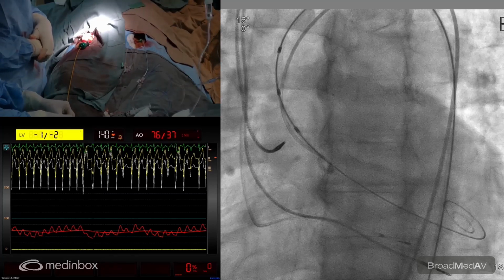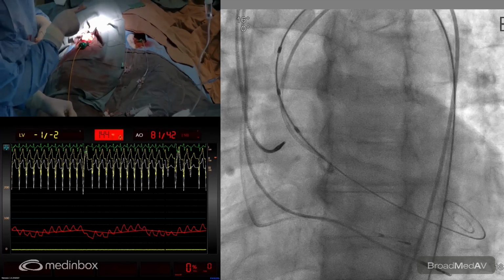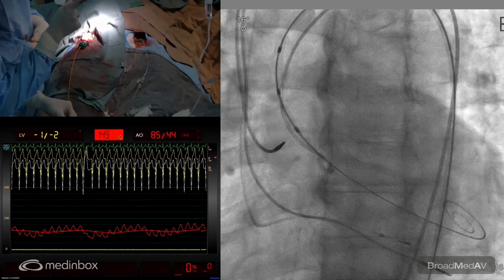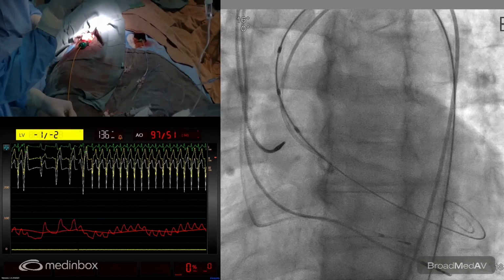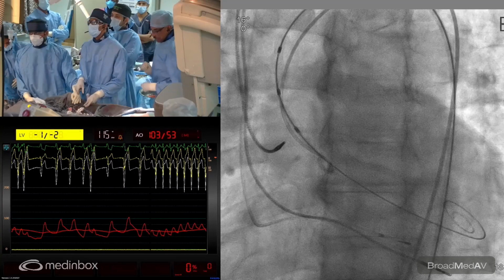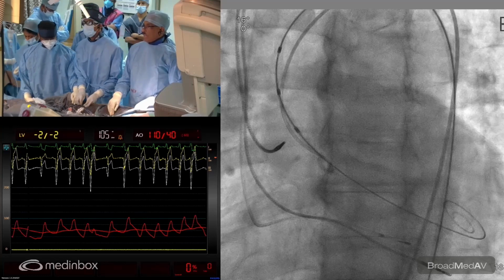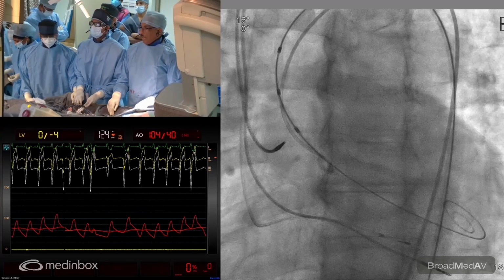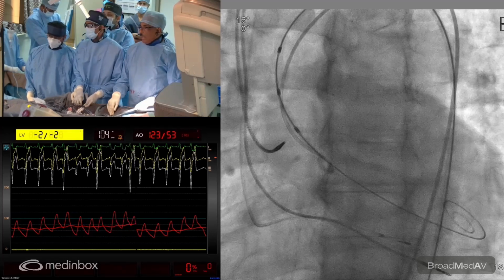Okay, just overdrive him a bit. No, sir. This patient is on pacemaker, no? I think maybe patient developed some atrial arrhythmia, so it started tracking. Okay, it's settling down. Okay, good. I think the problem was that he has a dual chamber pacemaker inside. That may create an atrial tachycardia. That's what Nanda said smartly. So that means you solved that hemodynamic issue. So it's not a spontaneous VT.